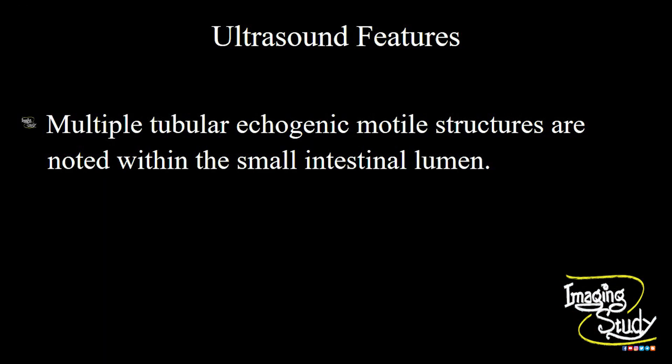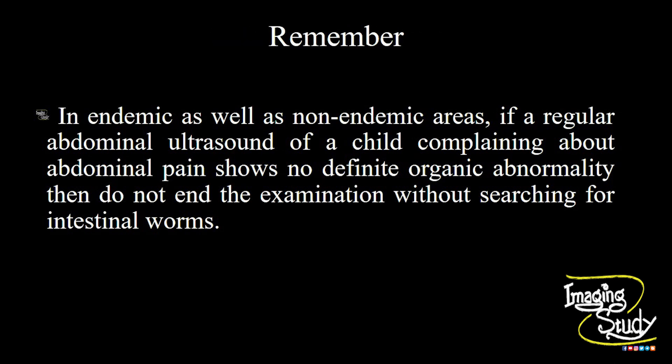In summary, multiple tubular echogenic motile structures are noted within the small intestinal lumen. The take-home message: in endemic as well as non-endemic areas, if a regular abdominal ultrasound with low frequency of a child complaining about abdominal pain shows no definite organic abnormality, do not end the examination without searching for intestinal worms with a high frequency linear transducer. You may get surprisingly moving worm-like or noodle-like structures within the intestinal loops.